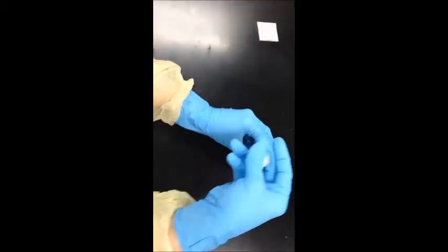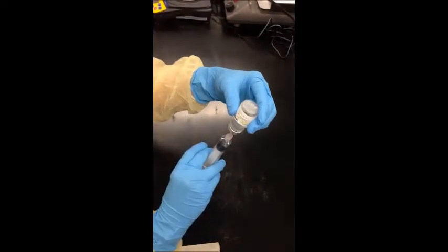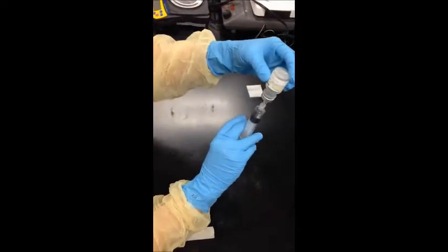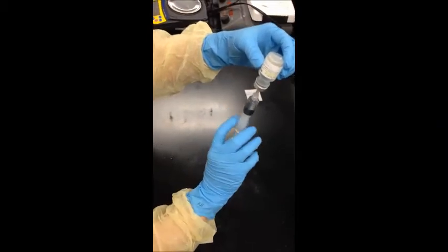Lift vial up with needle still in vial. Invert and draw up required amount of diluent into the syringe. Make sure not to block first air or touch any critical sites.